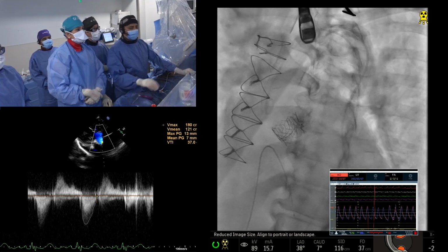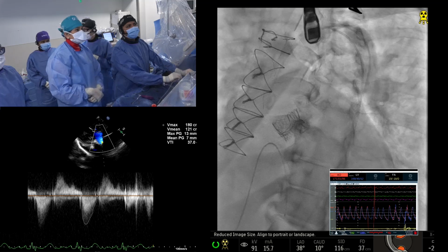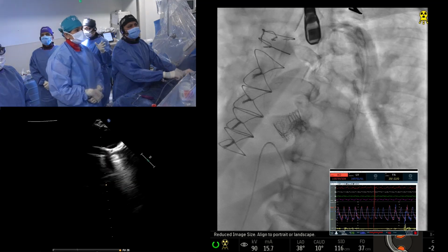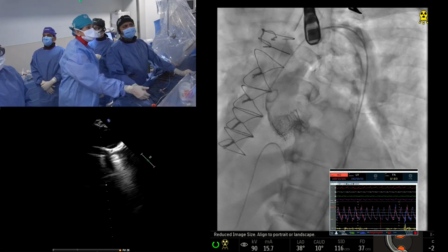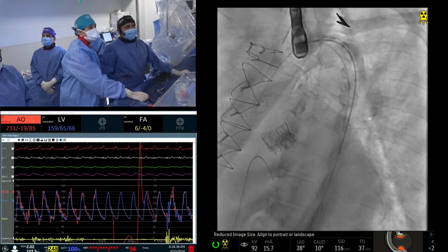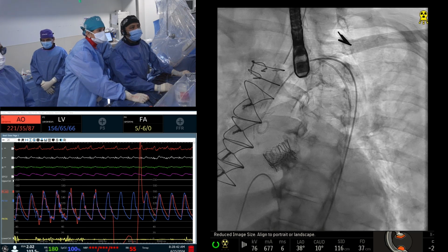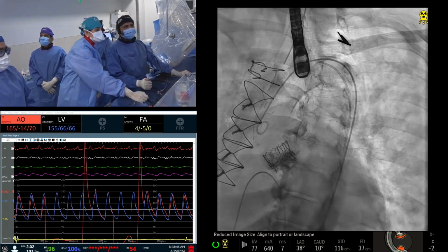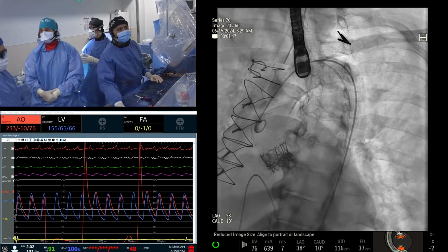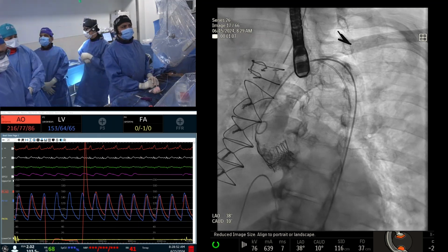When do you consider bioprosthetic fracture in your practice? Let's suppose this patient may not need it. Yeah, we routinely like to do it. If we only have isolated SAVR, we will fracture it, no question. But obviously, you have to look at the risk of coronary obstruction. Remember, when you fracture the valve, your VTC or VTSTJ may be smaller. So beware that you might acutely occlude the coronary if you're not paying attention, because you had not predictably fractured in a certain direction.